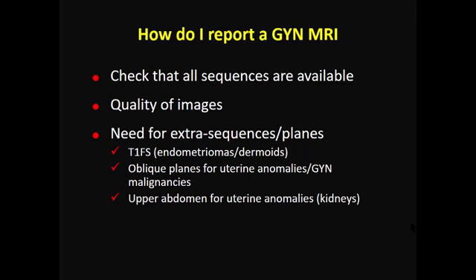And if you actually supervise your studies, maybe you can get away without giving contrast in certain conditions, and I'm going to reiterate that. But if you have a lot of scanners spread out, like we do along New York and New Jersey, then you are probably better off having a standard protocol which is followed, because you can't supervise every single study. But in a small setting, that is actually doable.